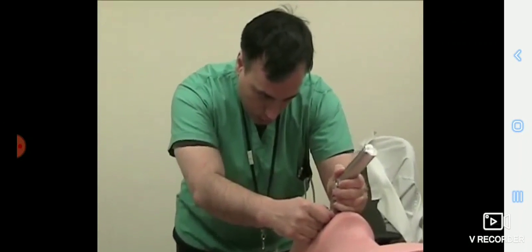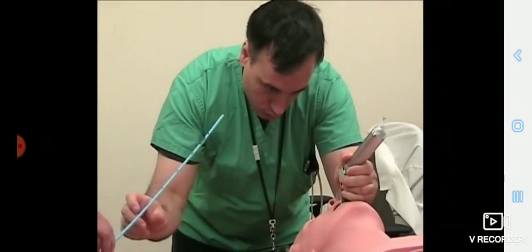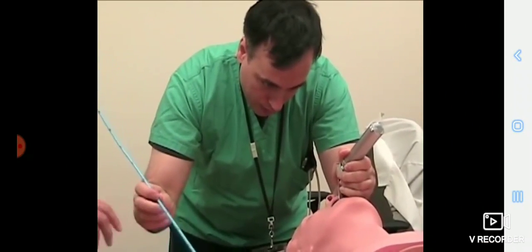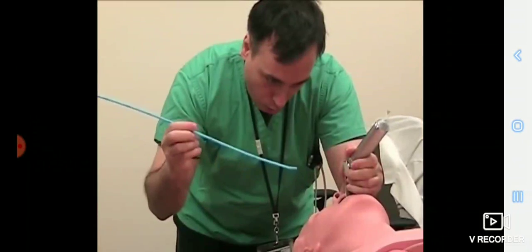So we're going to introduce the laryngoscope into the mouth just like normal, and try to find the epiglottis. You're trying to get the best view of the glottis you can find. But even if you just find the epiglottis, you will be able to intubate this patient. That's a Cormack-Lehane grade 3 view.